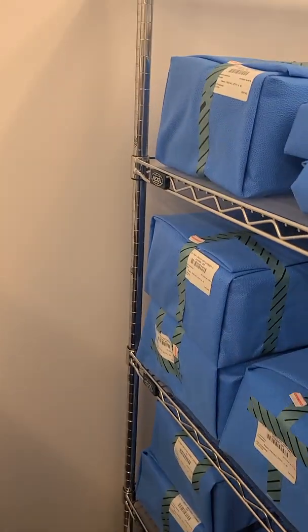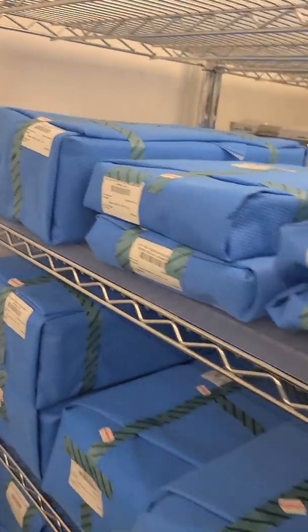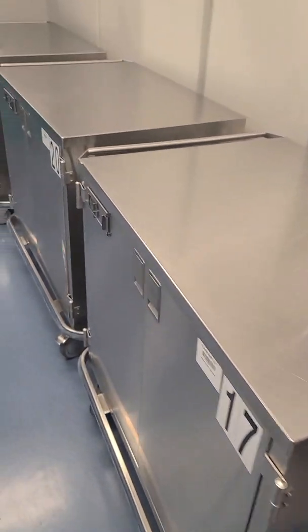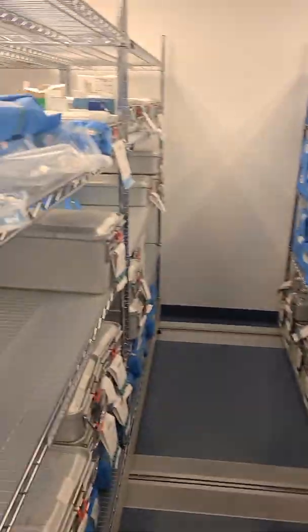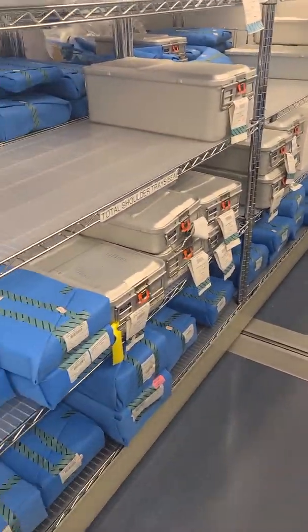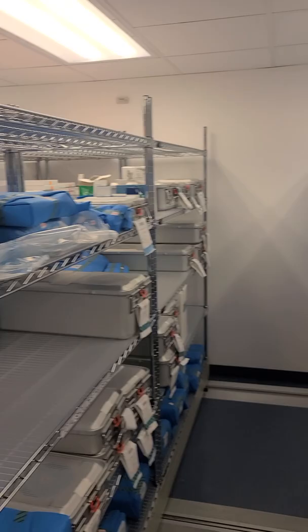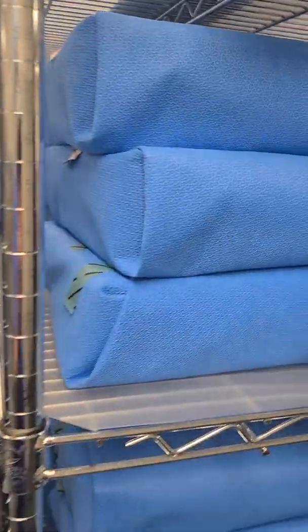A lot of guidelines and standards lead us to decisions we should make when it comes to sterile storage. Other things to consider is cleanliness of the environment — you don't want to be in a high-traffic area. This area here has empty case carts; that's just where we store the case carts. The actual sterile storage area houses the sterile items.